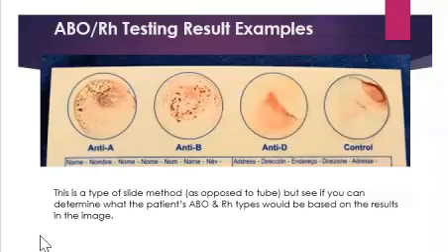So if you want to pause the video at this time and try to do it on your own before we get to the answer, you can. But let's go ahead and look at the result. Let's look at our anti-A. This would be our antibody A reagent. We can obviously see there's some clumping, so there's been agglutination here. Our antibody B, or anti-B reagent, there's also clumping.